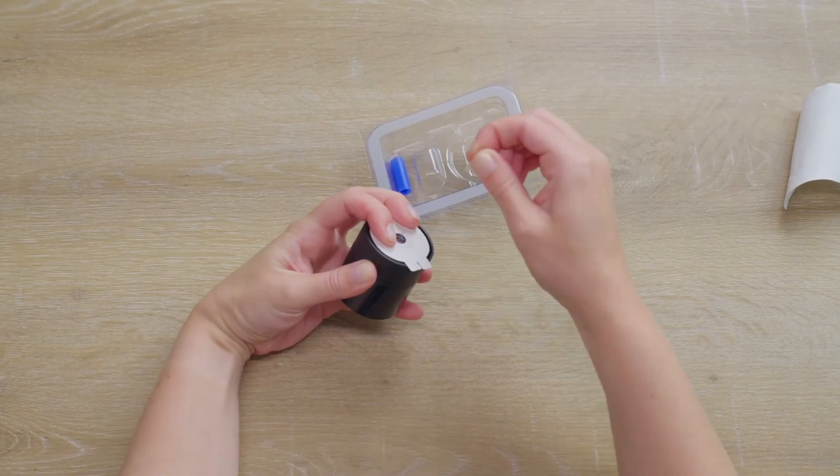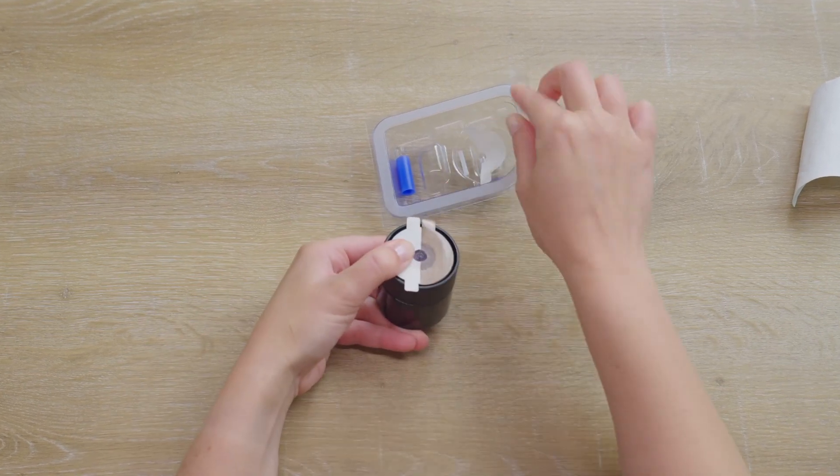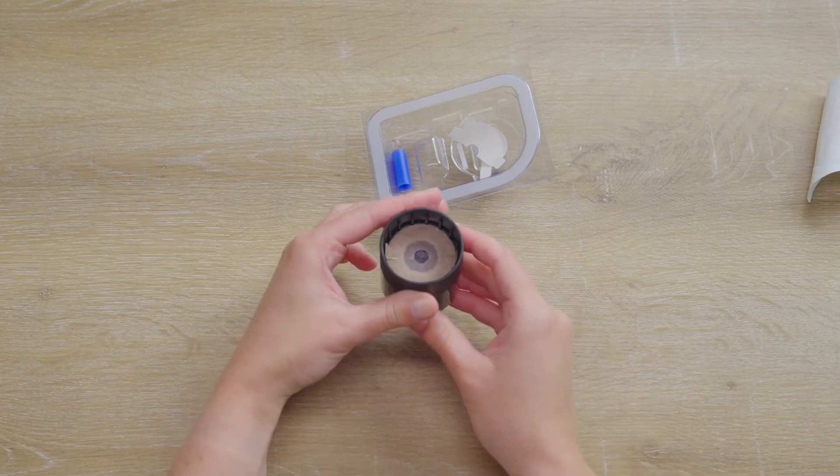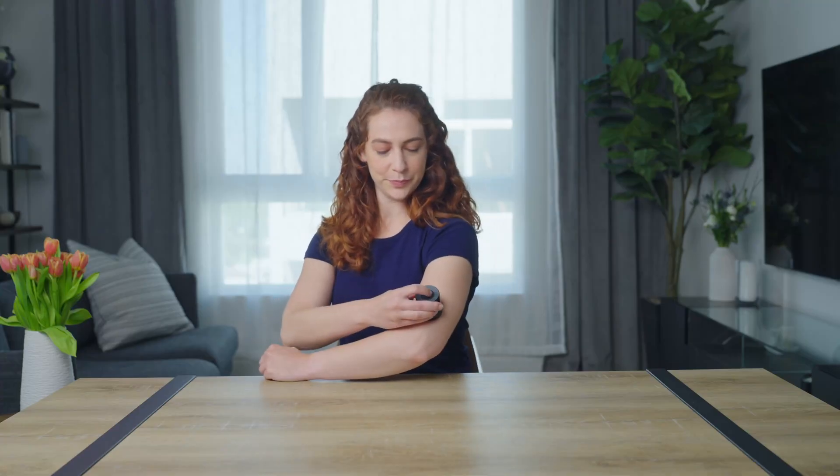Simply press the inserter, remove the cover to expose the needle, remove the adhesive liner, cock the device by twisting, place it on the body where desired, and press the launch button to insert.